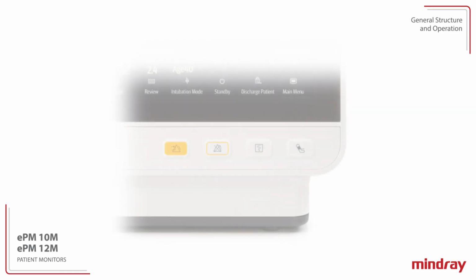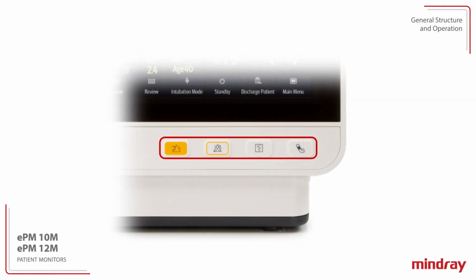There are 4 permanent keys in the lower right area of the ePM 10M and 12M patient monitors. The alarm reset key acknowledges alarms and resets the alarm notification. The alarm pause key pauses alarms for the configured time period. The record key starts a real-time recording or stops the current recording to the integrated thermal recorder. The NIBP key starts a non-invasive blood pressure measurement or stops the current non-invasive blood pressure measurement.